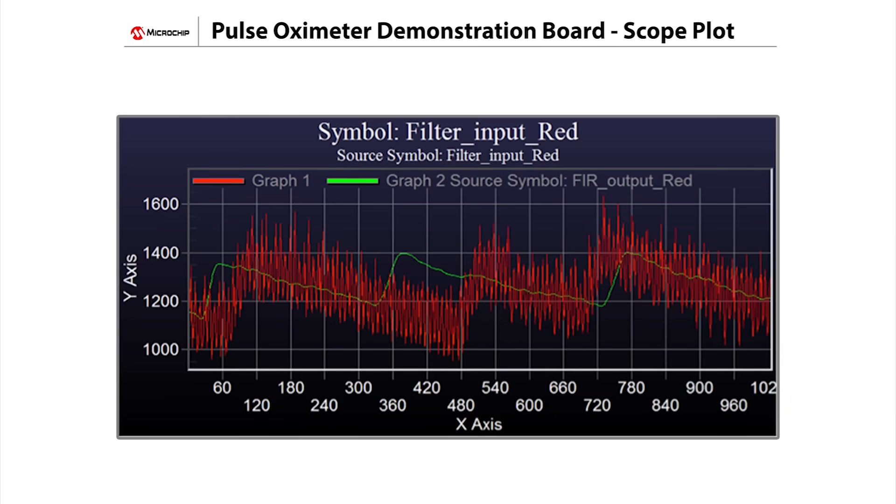On this scope plot, the input signal to the filter is shown here in red. The output of the DSPIC33's FIR filter is shown here in green. This stable filtered output signal is then used by the DSPIC33 to calculate heart rate and blood oxygen level.